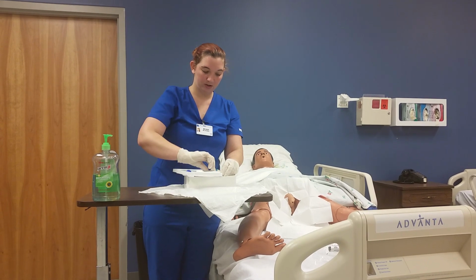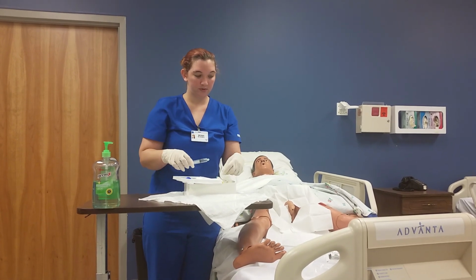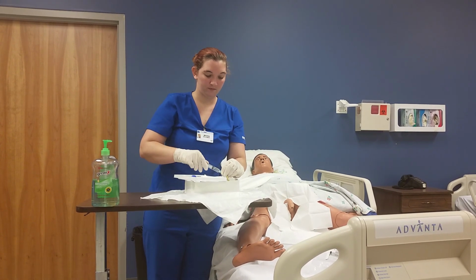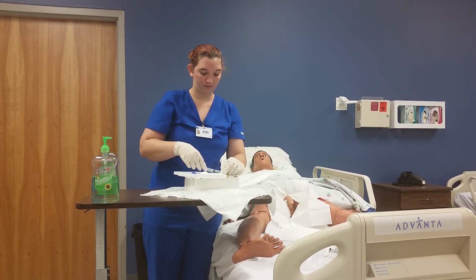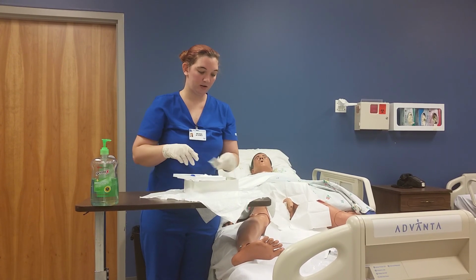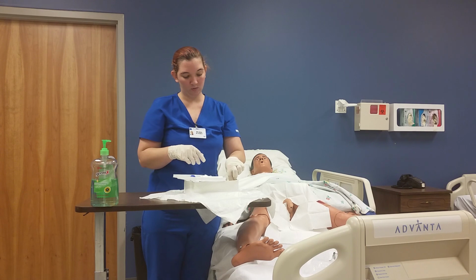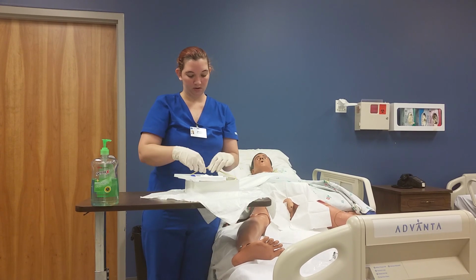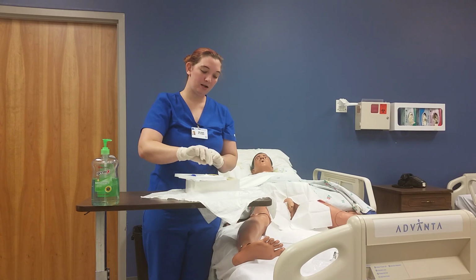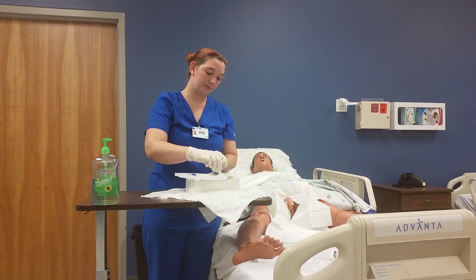I'm going to go ahead and hook up my syringe. I'm going to get rid of my cap because I don't need it. Now that that's open, I'm going to open up my lubrication, pour some here. I'm going to get rid of that because I don't need it anymore. I'm going to go ahead and lubricate my catheter. I'm going to take my normal saline and pour it onto these.